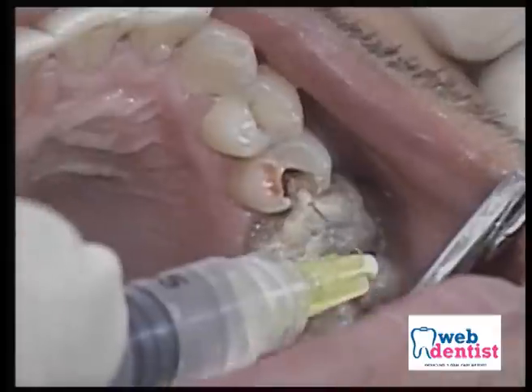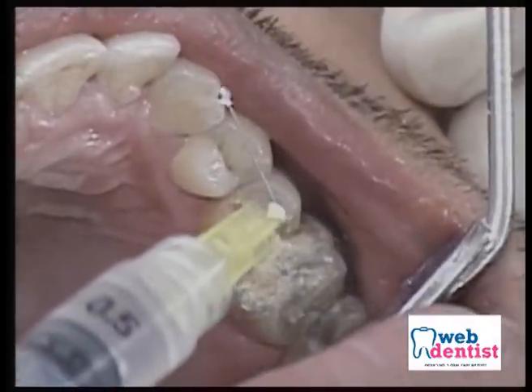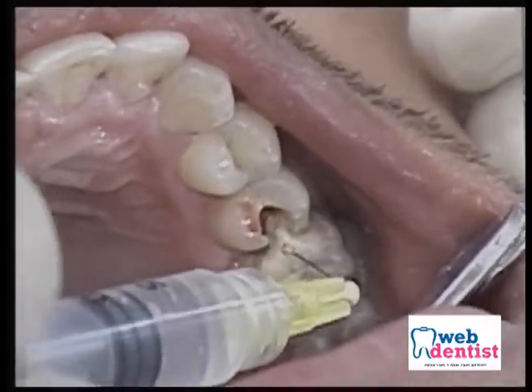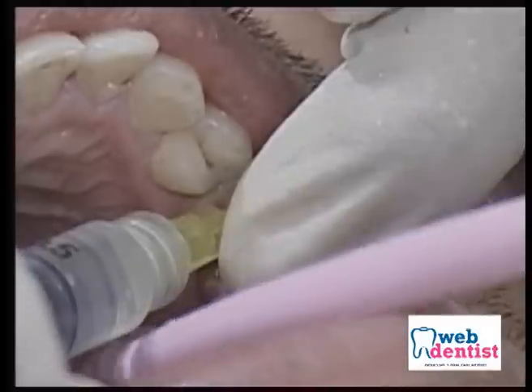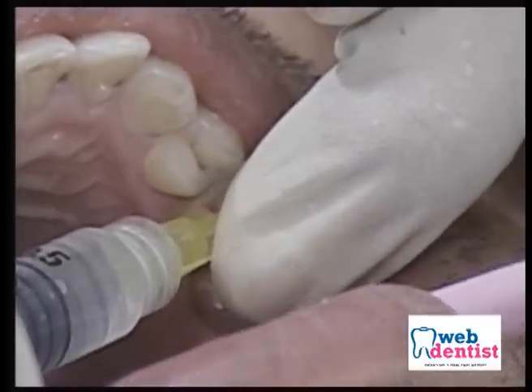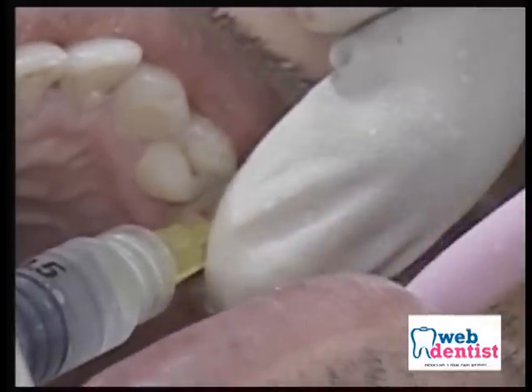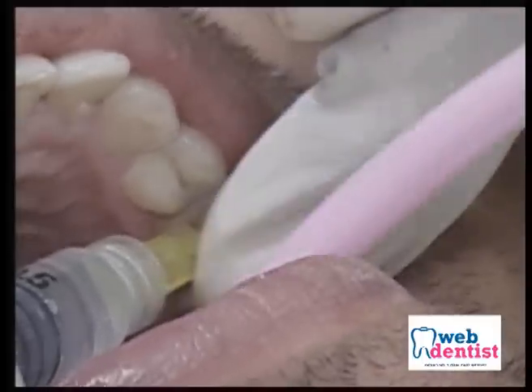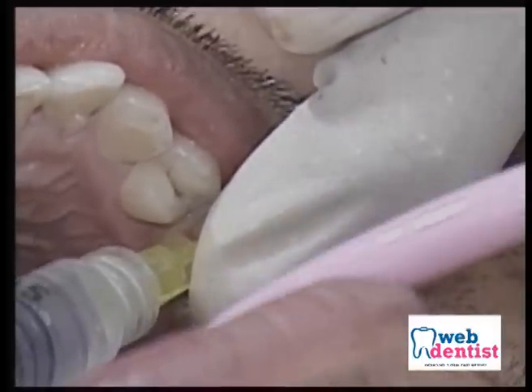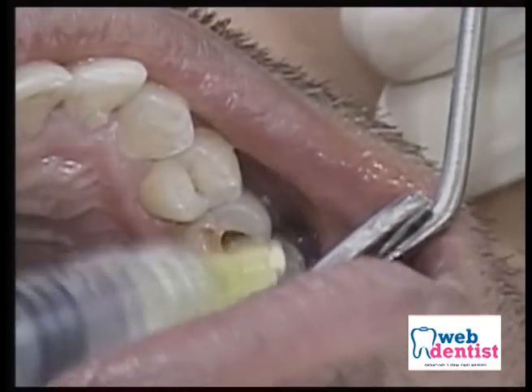As I showed you, you almost develop a drop. You have already started giving pressure, and you enter inside and you immediately develop pressure inside. See, I'm pressing on the piston of the syringe, and no anesthetic solution is going further. I'm giving a lot of pressure, but it is still not going. That simply means I could develop pressure inside.